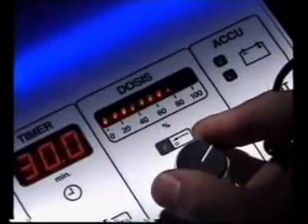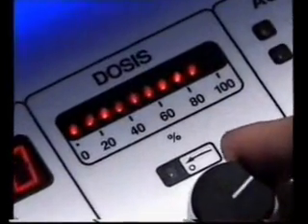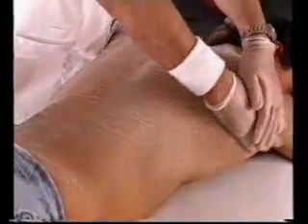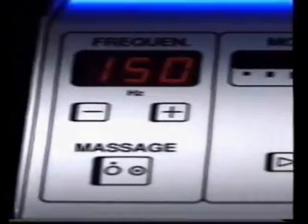Dosage during Hivamat 200 therapy is adjusted following the principle of minimal intensity. Most of the time, a low dosage is sufficient to provide an effective resonant vibration.